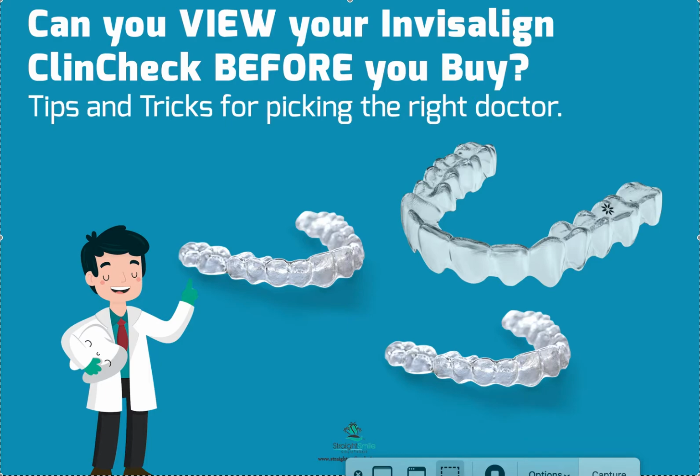What kind of cracks me up is these patients will get to the end of their treatment and say, I don't like this. And I say, well, did you ever see the ClinCheck? Did you know what you were getting? Maybe what you thought you were getting is not what the doctor thought you were getting. The only way the two of you can really communicate is to look at the ClinCheck together. If this doctor doesn't know what he's doing, or perhaps what you thought was possible isn't even possible, why would you start treatment? I don't get that.